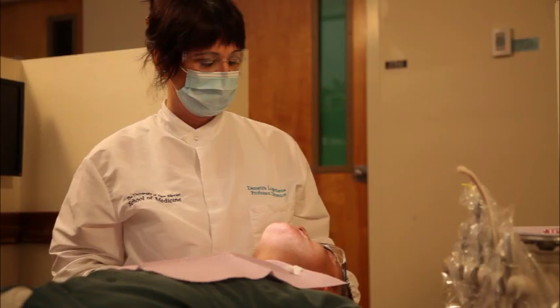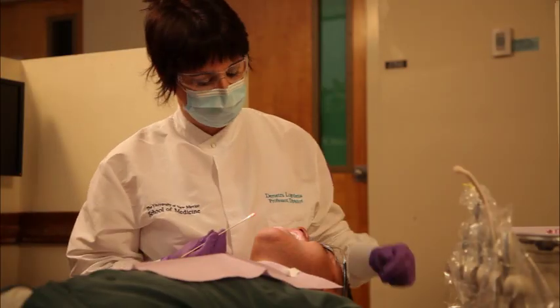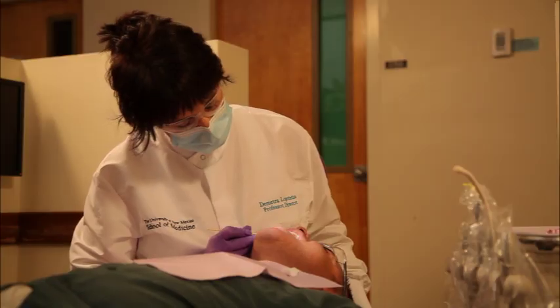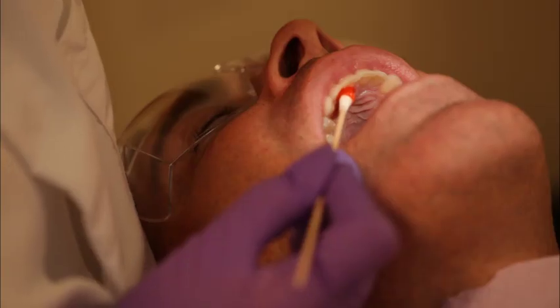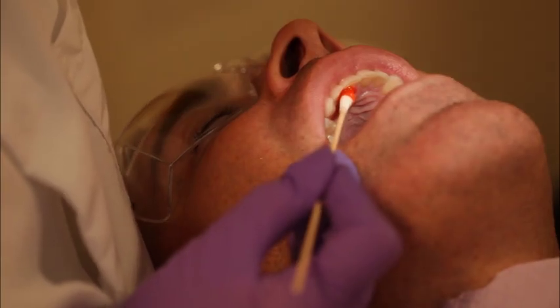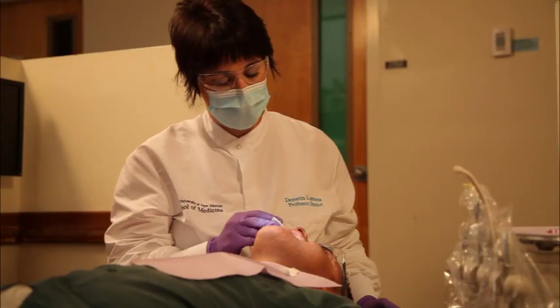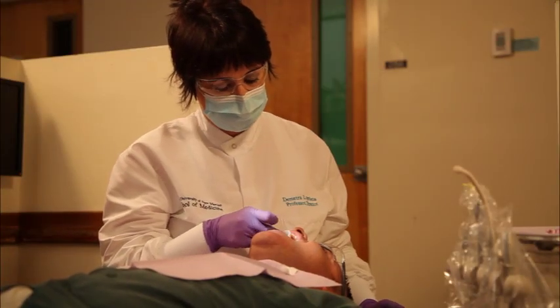Assume the correct operator position for a right-handed clinician at 11 o'clock and a left-handed clinician at 1 o'clock. Ask the patient to open his mouth and extend the neck comfortably backward. Dry the penetration site and prepare the tissue with topical anesthetic on the lateral side of the incisive papilla toward the operator, placing pressure on the papilla. Topical anesthetics are most effective for patient comfort when applied for 1 to 2 minutes. Dry the tissue to remove excess topical anesthetic.